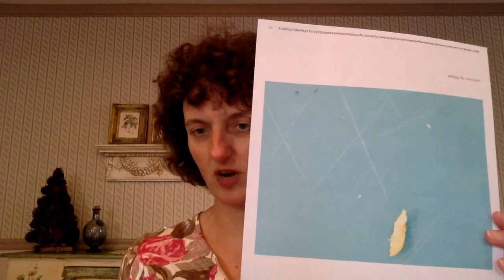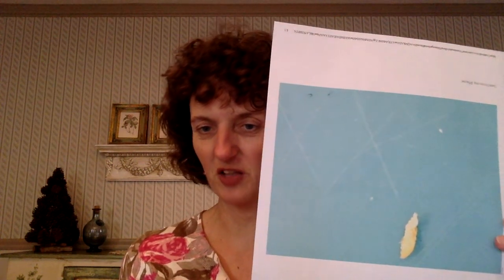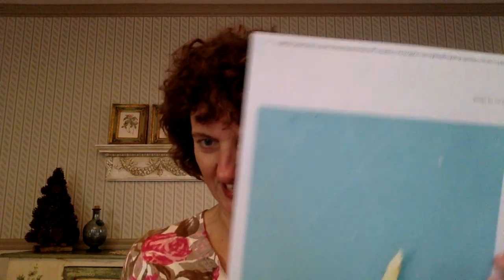I've taken a lot of photographs that I'm posting along with this video. I've also printed them out so that I can show you the photos as I'm describing the experiment that I did today. So first, I took some wheat-based crackers and I placed them on a cutting board. I removed the crackers and I was left with some crumbs. There's a very big piece of cracker there, but there are also a lot of smaller crumbs that you may or may not be able to see.